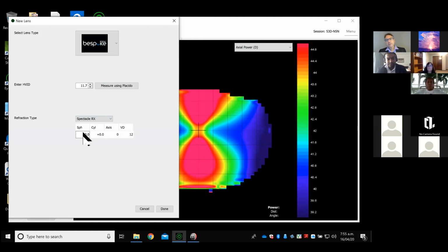So from the patient's experience, they come in, you have a discussion, you decide to do a GP lens, you do a couple of corneal maps, you do your spectacle prescription plus the other peripherals that you're going to do with the eye test, and you send your patient home. Next time they come back to you, you already have a finished product. So by the time you put the lens on the eye, it's already optimized for the eye shape and the optics are already in place. So the first introduction of your patient to a GP lens is a fully functional and well-aligned lens.